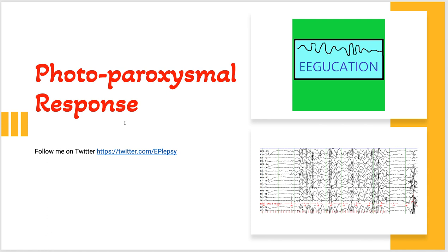In this brief tutorial I will not be able to go in extensive detail about photoparoxysmal response, but what we are going to do is I'm going to show you some samples of EEGs with photoparoxysmal response. I'll provide you with some pearls and this will be a brief tutorial.